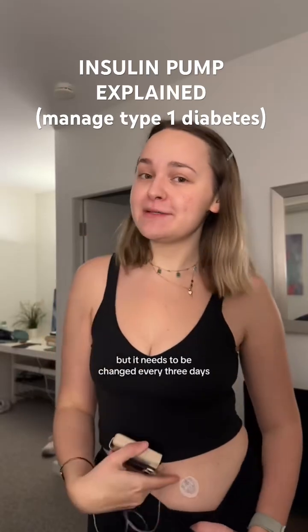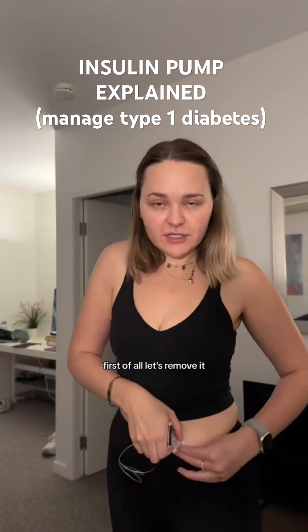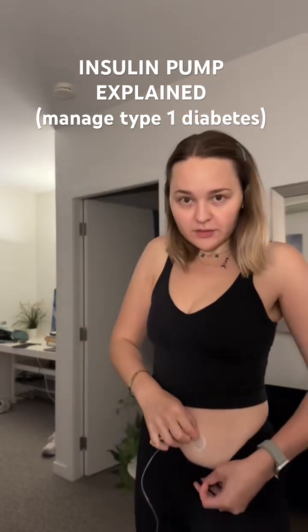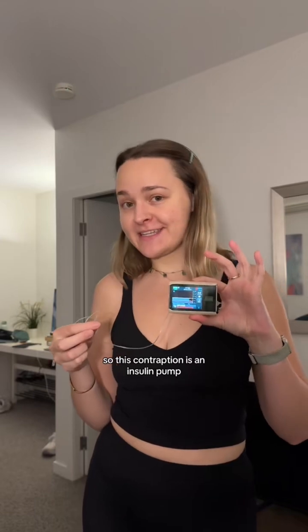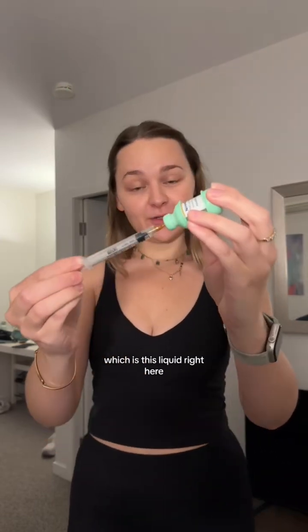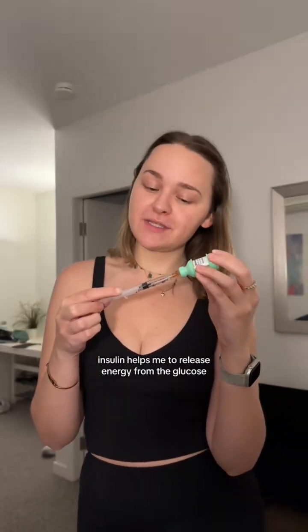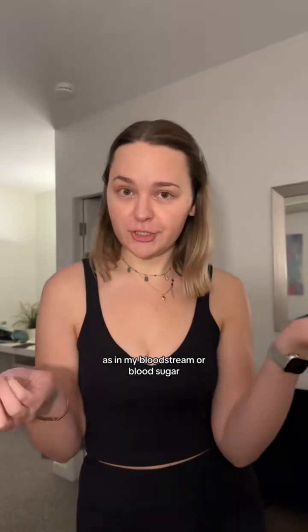This little machine keeps me alive but it needs to be changed every three days, so let's do that while I tell you what it is. First of all, let's remove it. This little contraption is an insulin pump. Because I have type 1 diabetes I need insulin, which is this liquid right here. Insulin helps me to release energy from the glucose that is in my bloodstream, or blood sugar.